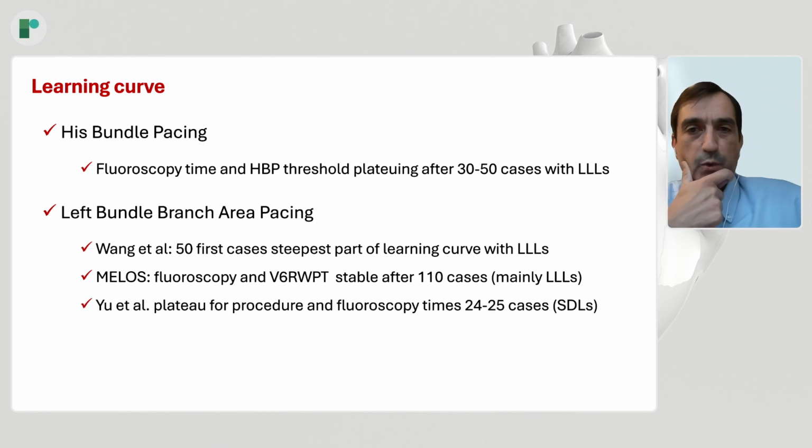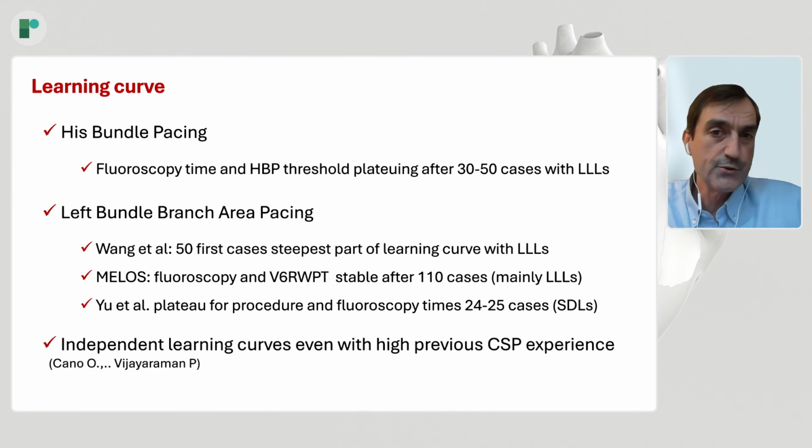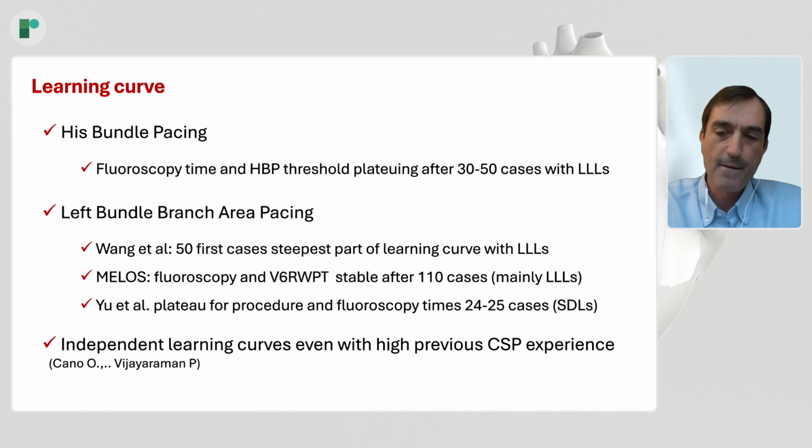With respect to the learning curve for stylet-driven leads, we have very few data published so far. But we know that we need around 24 to 25 cases in order to achieve the plateau for procedure and fluoroscopy times when using the stylet-driven leads. And we also know that we need to observe independent learning curves for both lumenless leads and stylet-driven leads, even if you have a high previous CSP experience.